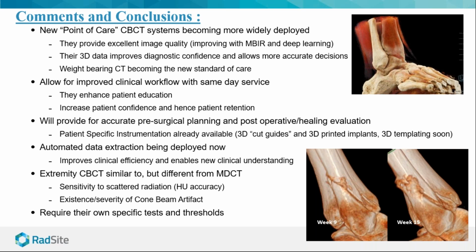If you look at this image up on the top right, that's actually an X-ray image displayed in what's called cinematic rendering, a new technique of 3D rendering. And it looks, quite frankly, like you've just stripped the soft tissue off and you're looking at a visible image of a bone. It's quite incredible when you see the capabilities that these guys are developing.